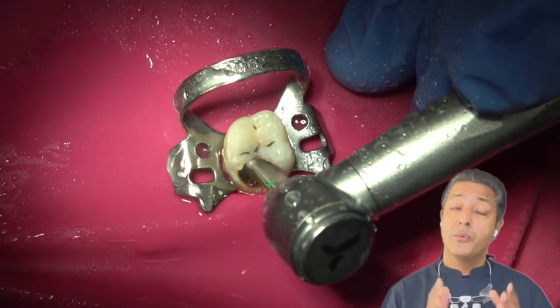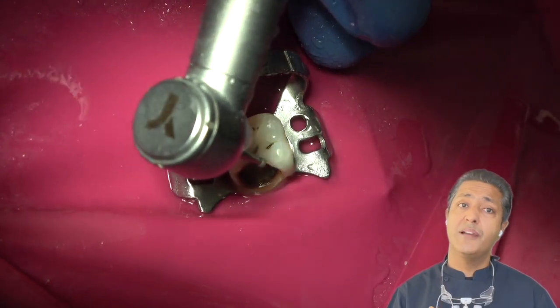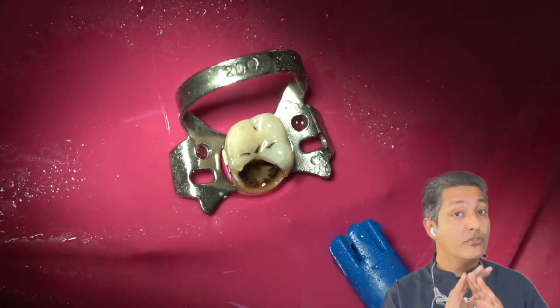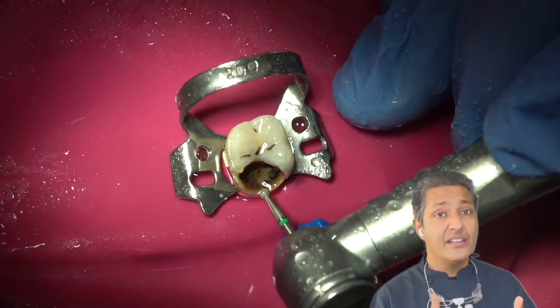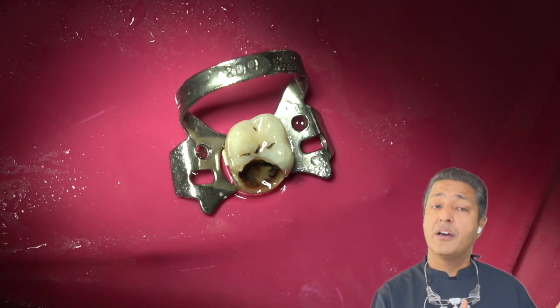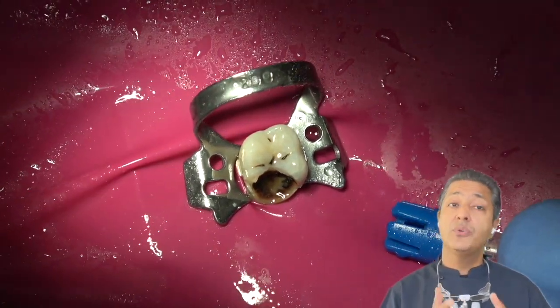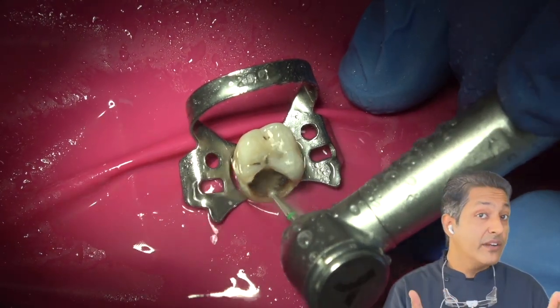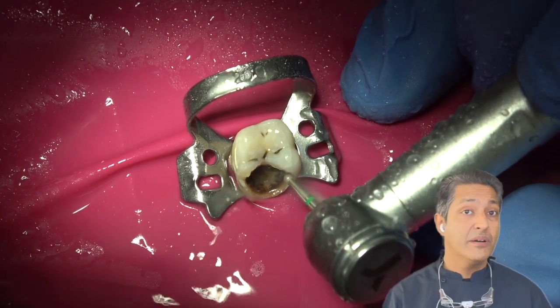Once the peripheral part is complete, we need to examine with the help of a blunt probe or a DG16 explorer, but no force has to be used during this protocol. You can see in the video that I am using a round burr, and it's a high speed diamond burr. We just need to touch the burr on the affected or infected part and the burr will do its job.